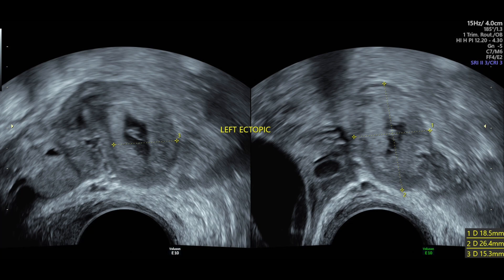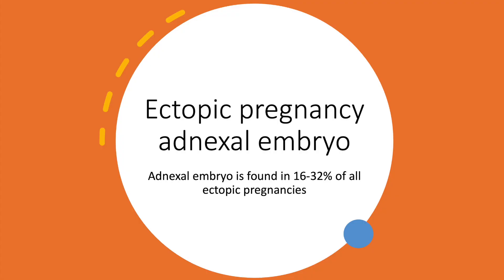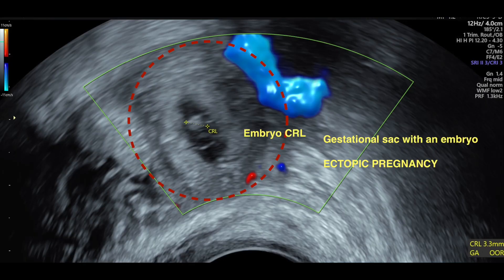This is another picture showing an ectopic pregnancy with an embryo. On the left side, presence of an embryo in the adnexal region is found in 16-32% of all ectopic pregnancies, as shown in this picture. CRL is the length of the baby that is being measured.